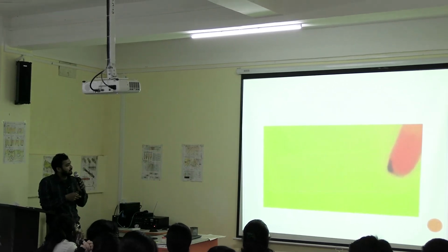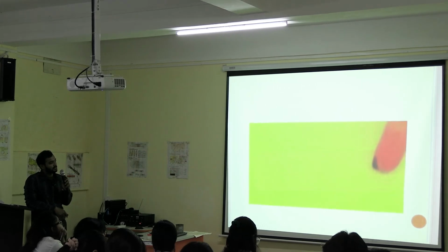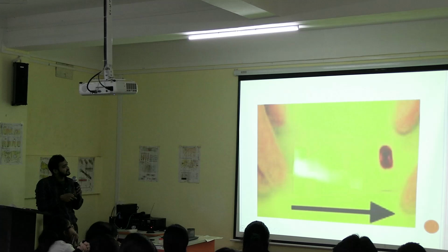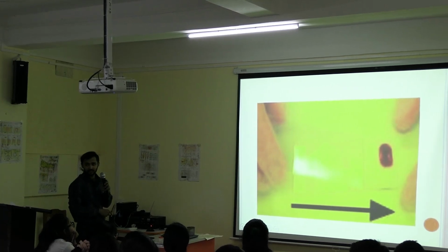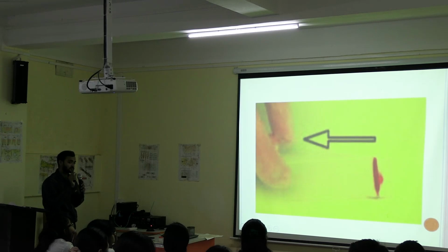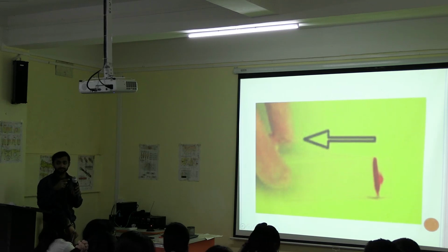So this is how, maintaining at least 1 centimeter, we put the drop near the edge, close to the edge of the slide. Then this spreader comes from the lower portion, going towards the blood drop. After touching it, you have to wait so that the blood spreads with the help of capillary action.